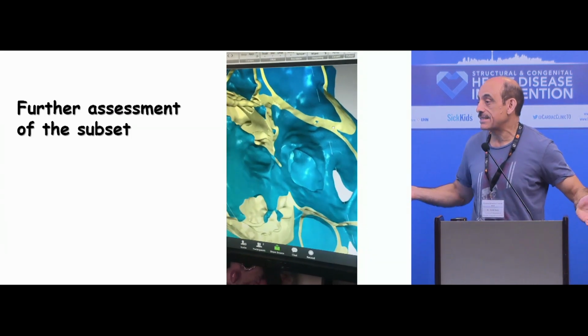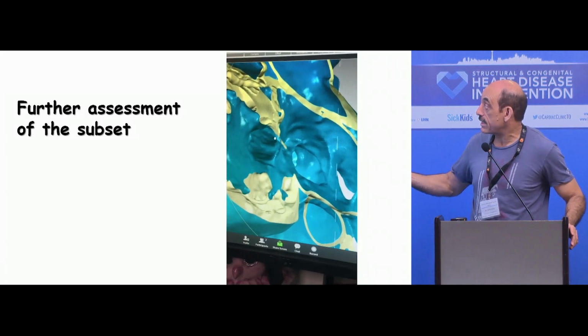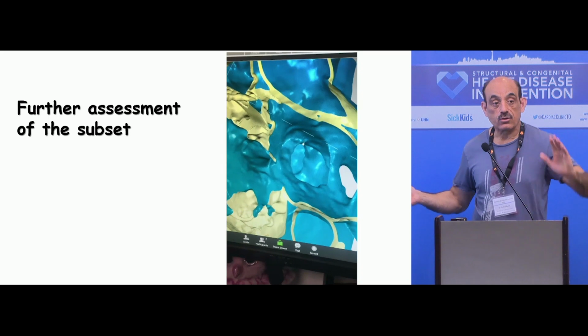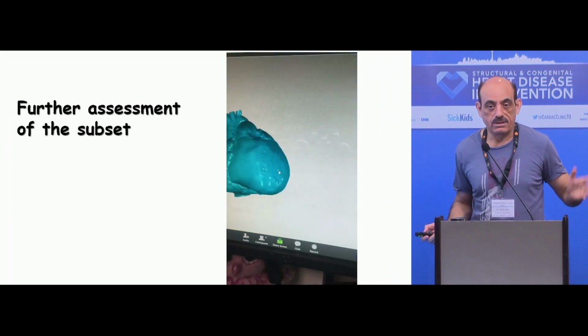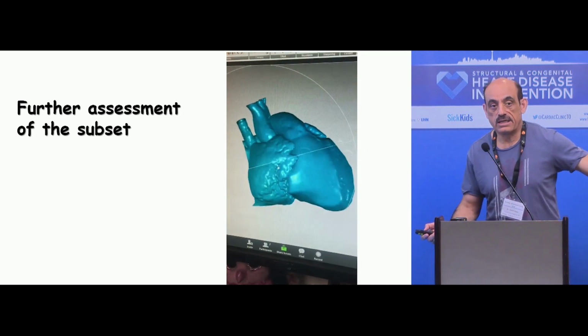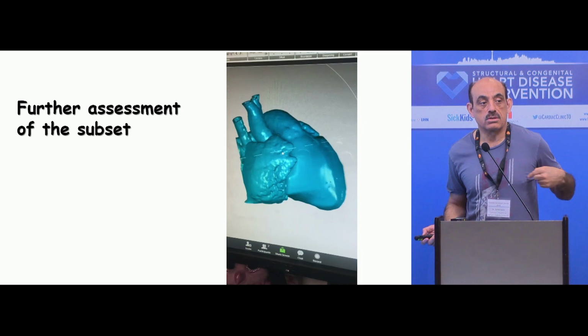Where should the device sit when I'm doing TEE? There is actually absolutely no rim. If it is there, it always sits cattywampus. Should I leave it? I could wedge a big device, but am I doing justice to this very young baby? Remember, I told you guys, keep in your mind, would you do that to your own son or daughter?